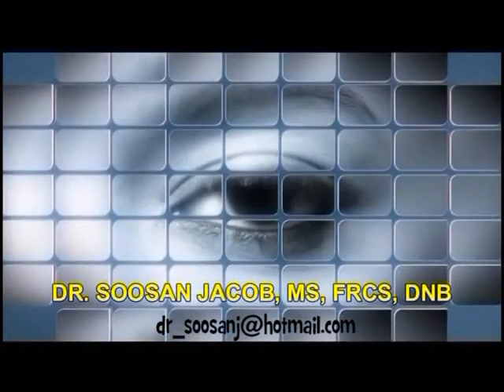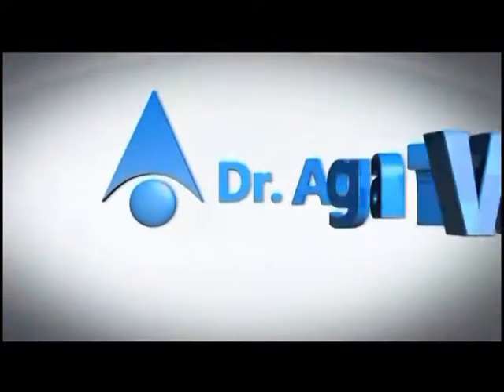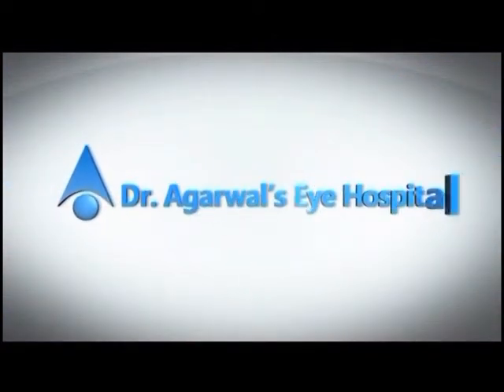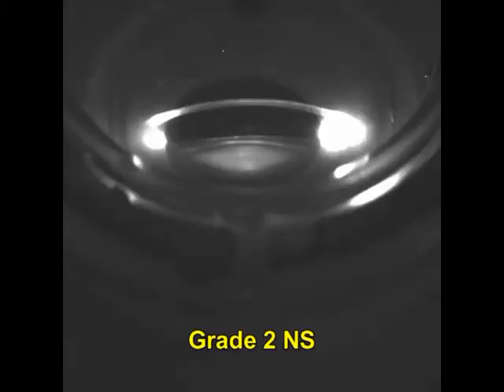Hi everyone, I'm Susan Jacob and in this video I'm going to show you another case of femtosecond laser assisted cataract surgery, or FLACS. In this case we will see the use of a two-plane chop in a grade 2 nucleus sclerosis.